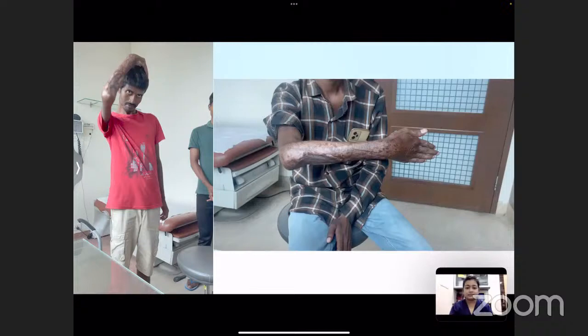Good clean, nice clean, thorough cleaning is very good. You can see now, this is the example. He didn't have any sinus, no infection, anything, absolutely fine. You don't need to put all those things. That's what I feel.